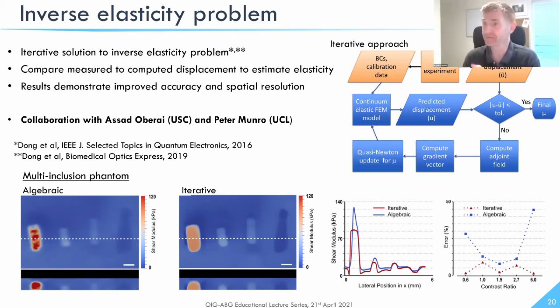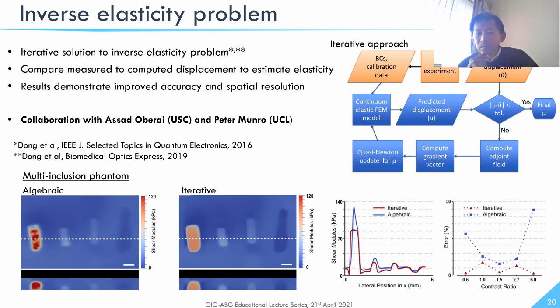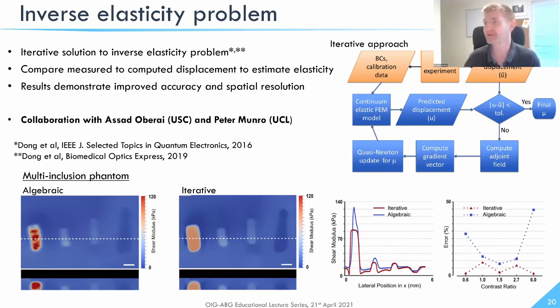So definitely, I think that's. I'm not a mechanical biology expert per se, our collaborators are, but I think the field has shown that there's a big difference in the response of cells depending on if they're in 2D or 3D and if they're on a hard surface or not. So we feel that we have an advantage in that we can see potentially in 3 dimensions. AFM, for example, is limited to 2D, and so definitely if we can improve the resolution so that we can really see the different components of the cell's elasticity as well as the material that it's embedded in, then it could be useful in that regard. But it's not something we've looked at too much until now. Maybe I should look at more.